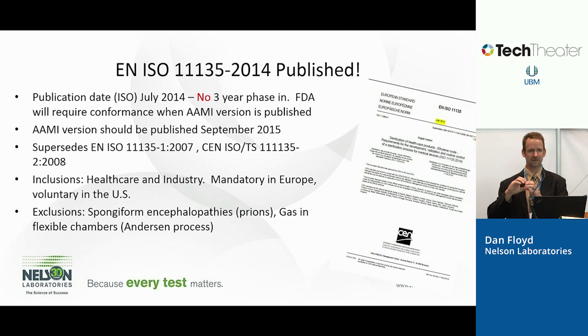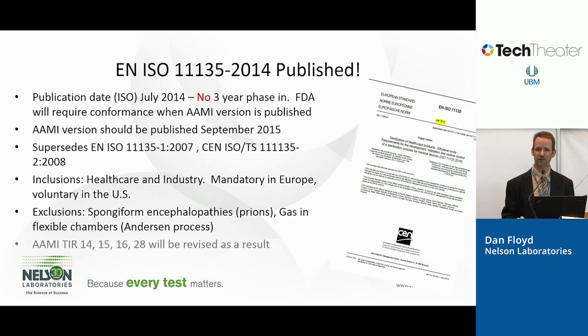It's almost a semi-permeable bag, so it's almost non-permeable. So the gas slowly diffuses out of this bag over this 16 to 18 hour period. And so it excludes that. There's a separate AAMI document for this type of process. So this document does not apply to that type of ethylene oxide sterilization.